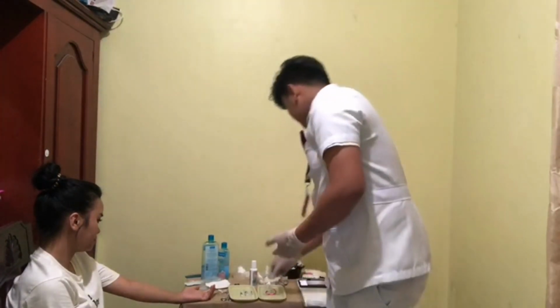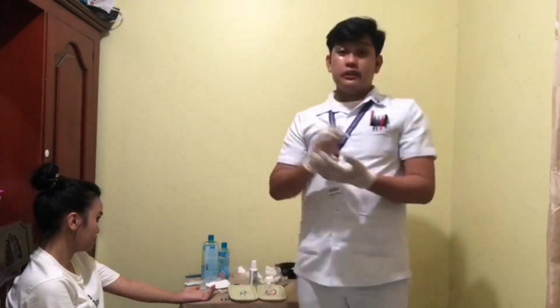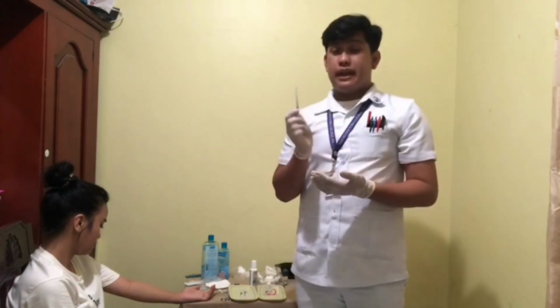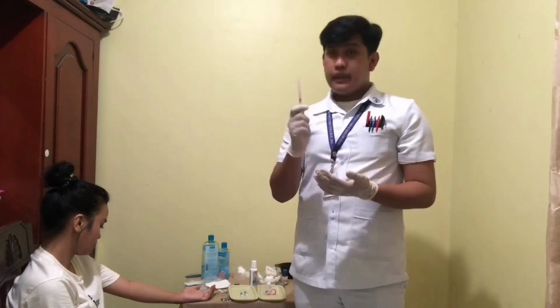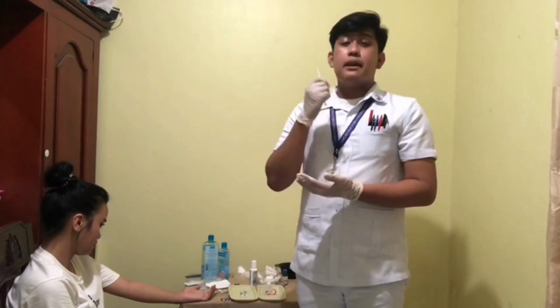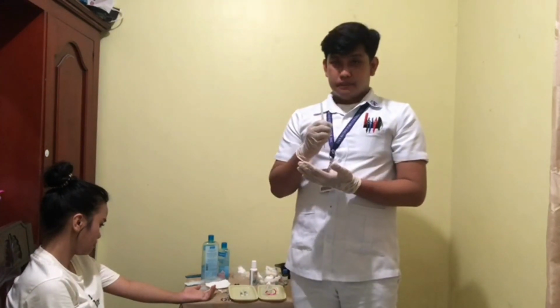After that, now we'll prepare the syringe for the injection. In holding the syringe, we'll use our dominant hand, which is my right hand. Close to the hub, hold it between the thumb and four fingers, making sure to hold the needle almost parallel to the skin surface with the bevel of the needle up, to maintain the sterility.